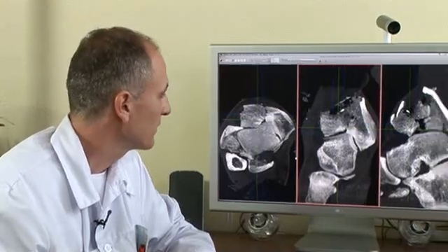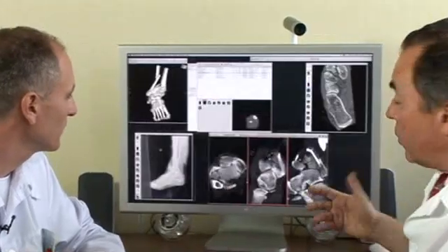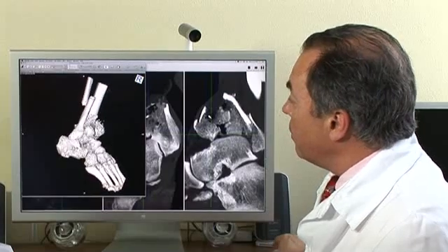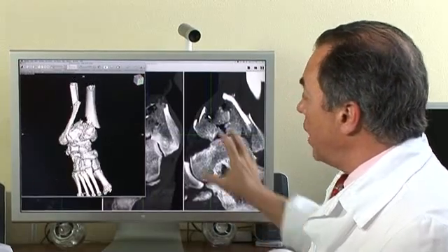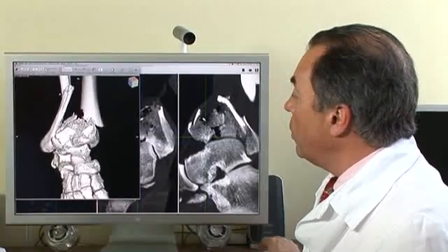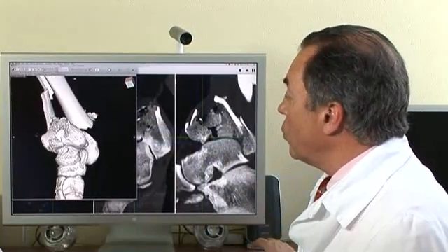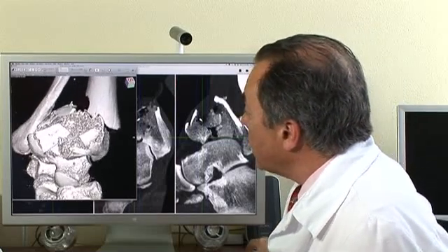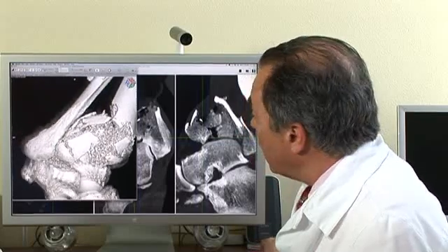We have seen multi-planar reconstructions. Now, are we able to see the fracture from the outside, to see its surface? You can do 3D rendering — traditional 3D rendering — and the software also has a very interactive view. These images are generated from those CT images, and you can navigate through these complex images the same way, zooming in and going for details, really moving things around to look at them.